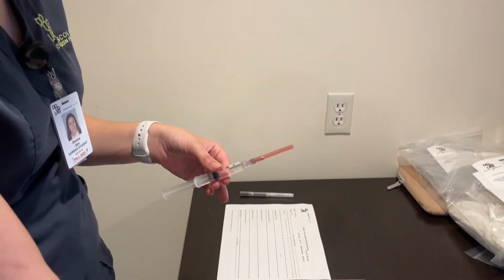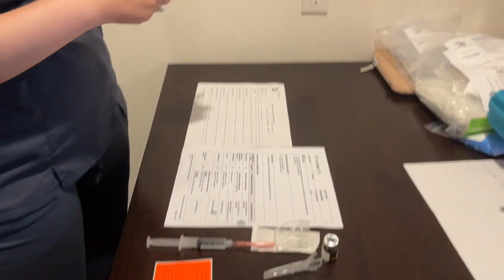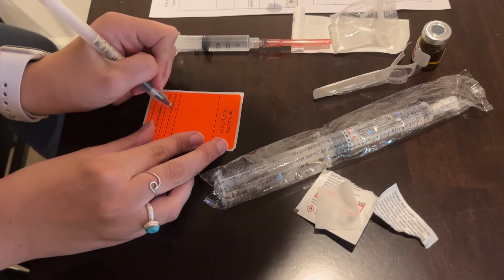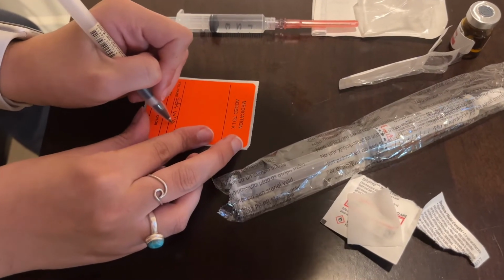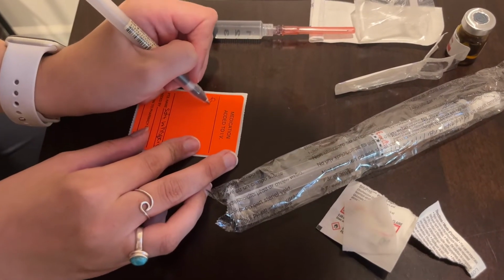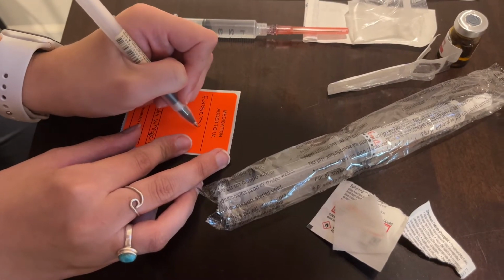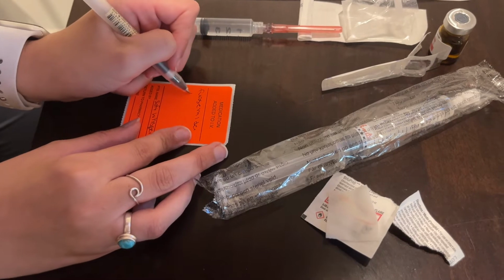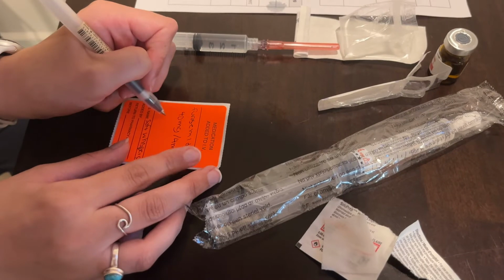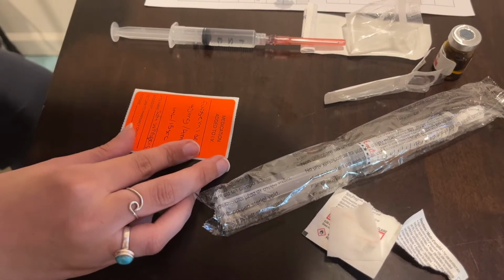After this, after I have my medication ready to go, I'm going to now label my medication. So we have the patient's name, so soft whispers, and this is furosemide, and it is 40 mg per 4 ml, and I'm just going to put 1 ml per 15 seconds just so I don't forget.